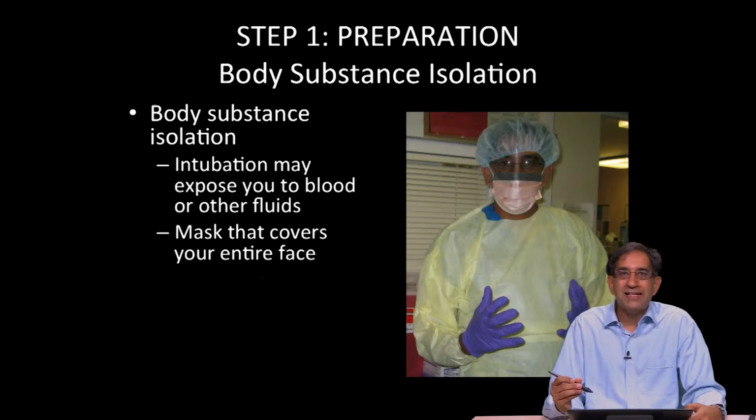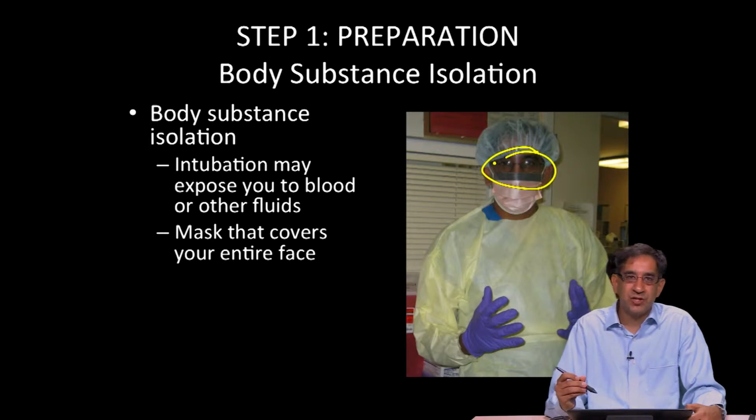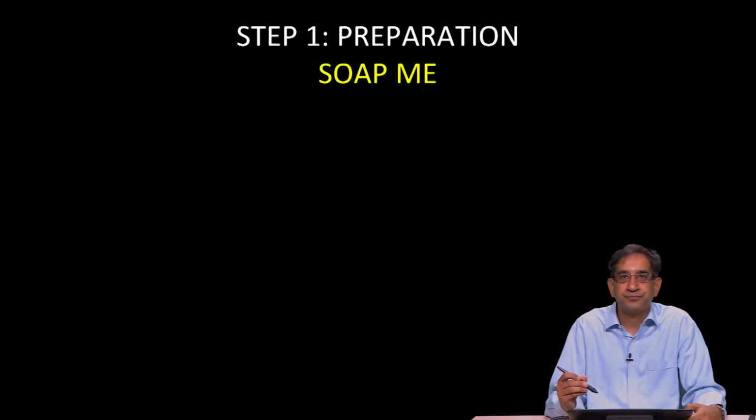With regards to body substance isolation, it's important to know that when you're intubating a patient, you risk exposing yourself to secretions from the patient. So it's very important to have gloves, a gown, something over your head, and a mask, and most importantly, some kind of eye protection that protects your eyes and really your entire face from splashes or secretions that can come from the patient. So body substance isolation, the first step.